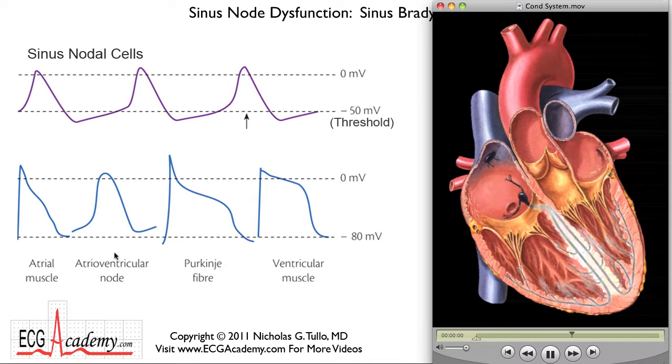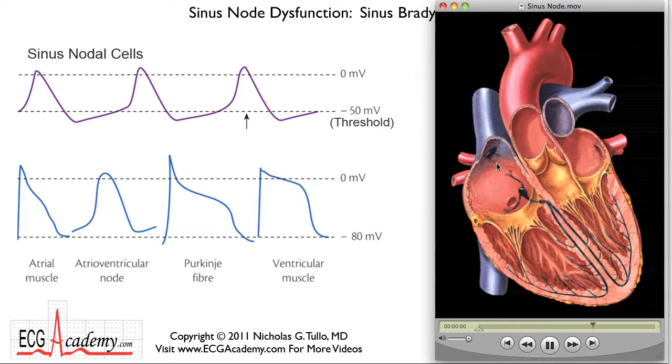Well, we'll get into the advanced physiology in one of the talks in the advanced level, but for now, let's just talk about the sinus node. Okay, so here's the sinus node in the top of the right atrium. It fires on a regular basis and it sends out electrical signals that generate the atrial depolarization. Those are the P waves.